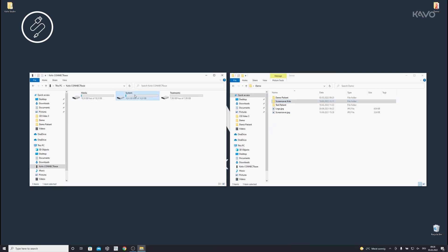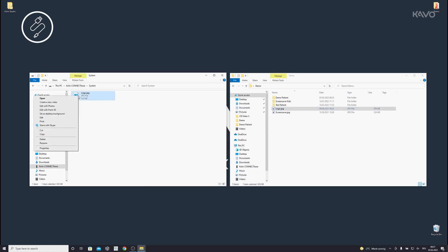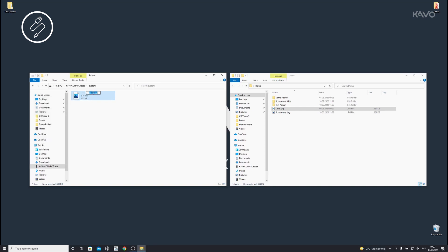To import your Office logo, open the System folder, copy the desired image to the folder, and name it Office.jpg. To import a screensaver, open the System folder, copy the image you want to the folder, and name it Wallpaper.jpg.